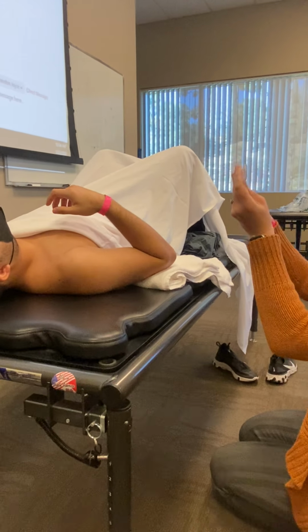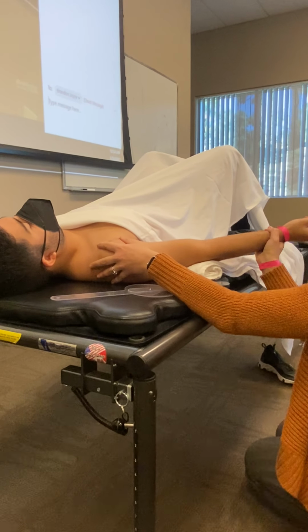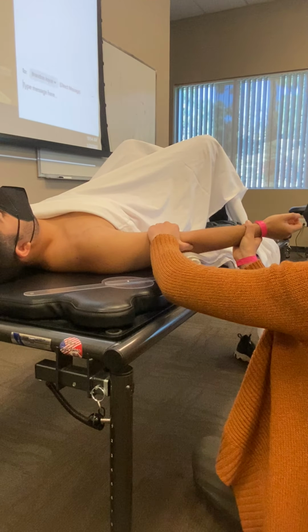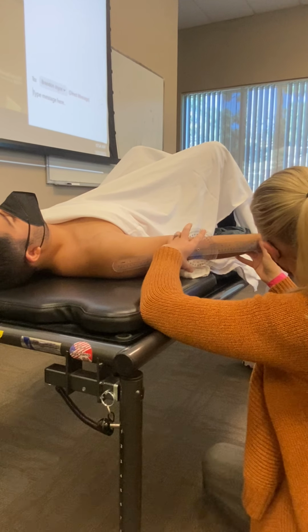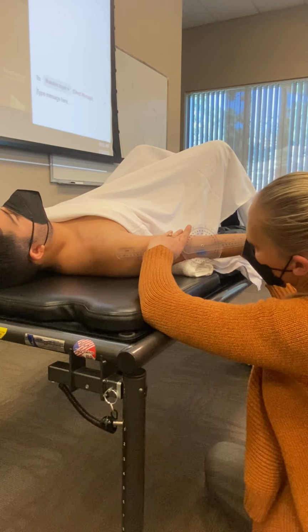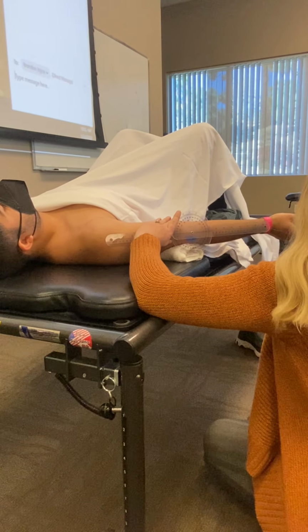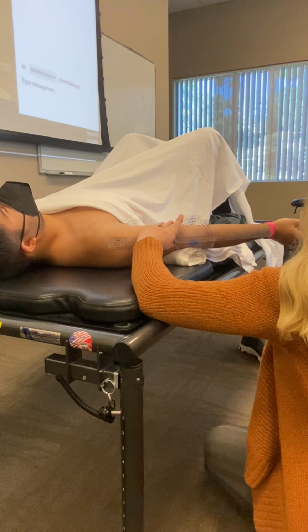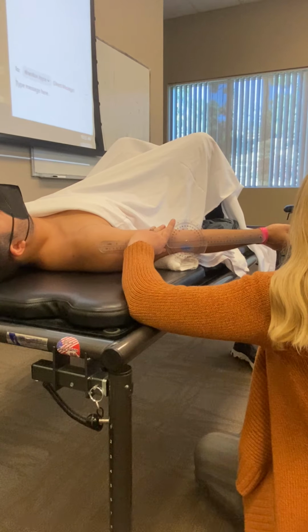So I'm going to bring him back. I'm going to preset my goni to 0. Bring him back, palpating those bony landmarks. And he is indeed 0 degrees elbow extension, normal being 0 degrees. Questions, comments, concerns about extension?